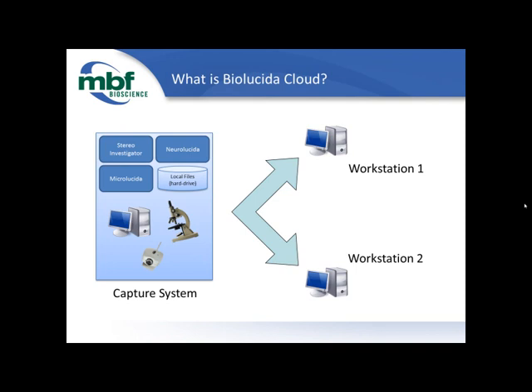Yeah. How do you think you might move that image? I mean, frankly, probably the easiest thing would be to set up file sharing on the capture system so that I could just move it through the network. But this is going to totally depend on whether the network administrator will even let me do that with the capture computer. If it's a core facility, I probably won't have those kinds of privileges, and I won't be able to actually create a shared folder. I mean, I guess it's possible. At the end of the day, I probably would just grab a USB stick and move things that way.